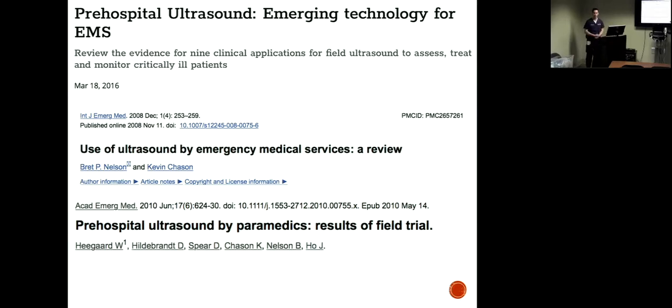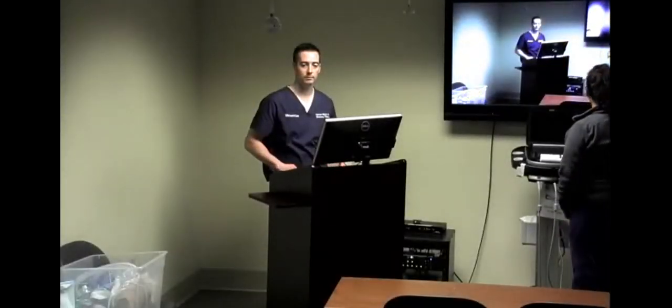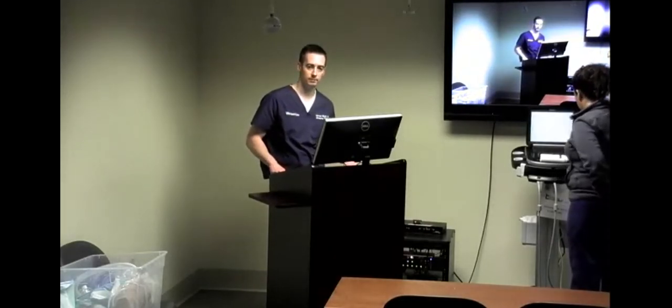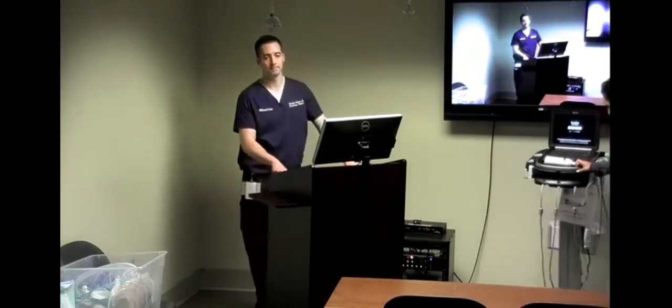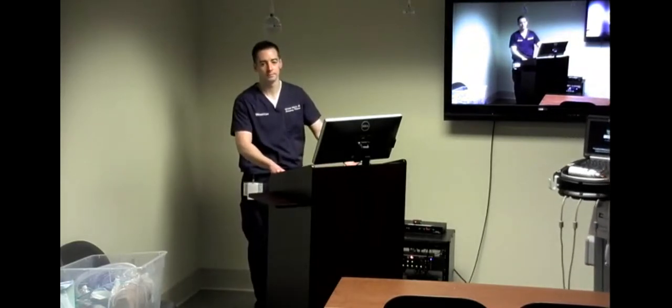And some of the literature I've heard in the last year, some of the more progressive places in the nation were using ultrasound on traumas, and basically saying if you had no kinetic activity of the heart on scene, you're pretty much done.